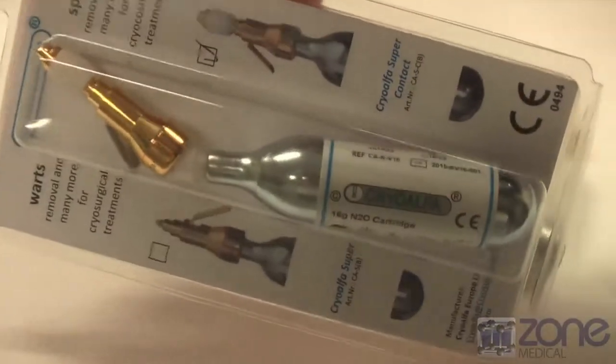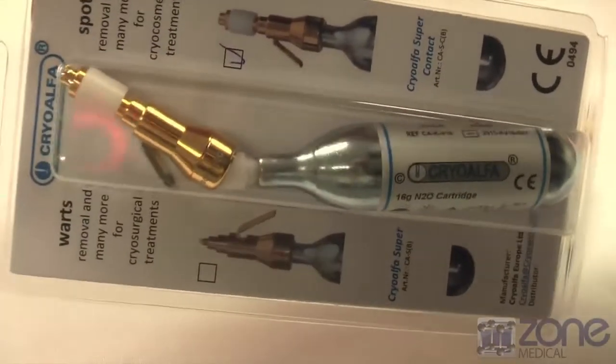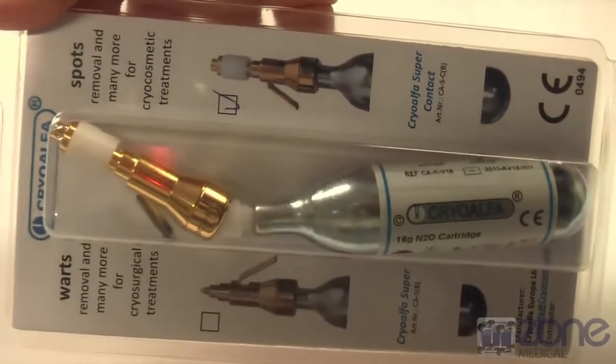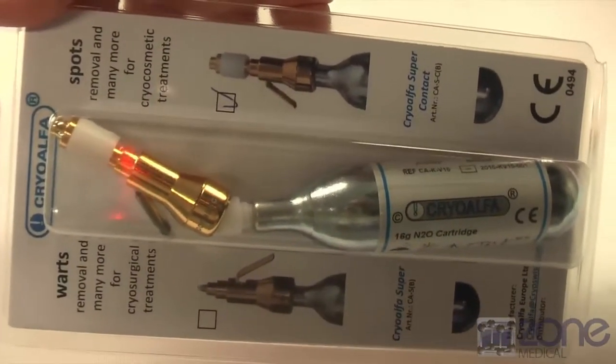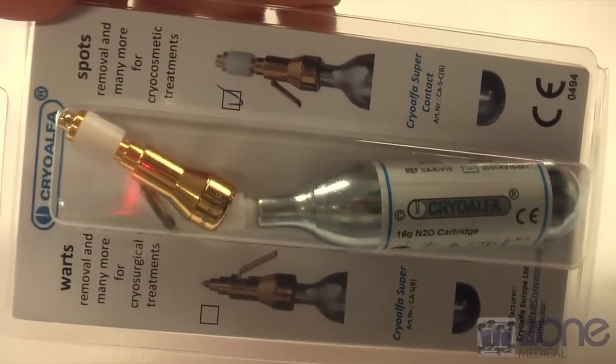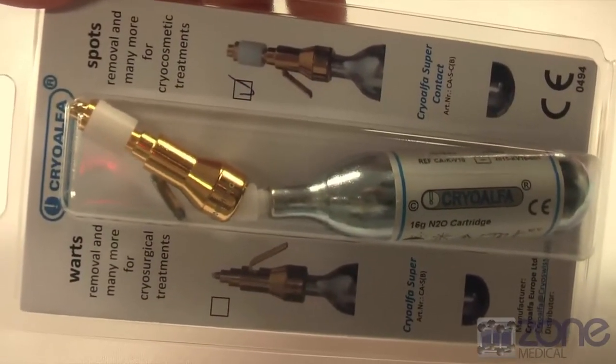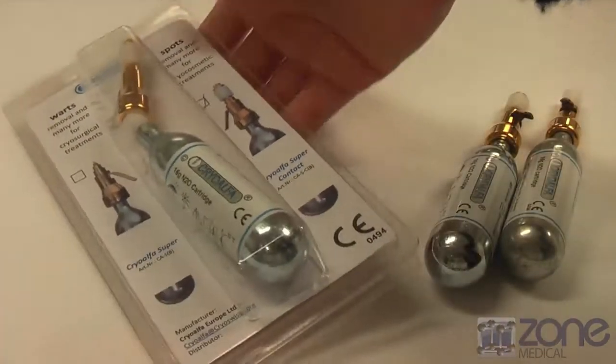This is the blister pack. It is a non-bleeding treatment with no anaesthesia required. It contains up to 300 seconds of gas, and the average application is 3 to 6 seconds, so there are 50 to 100 treatments per cartridge. This device doesn't have an expiry and is able to sit on the shelf.